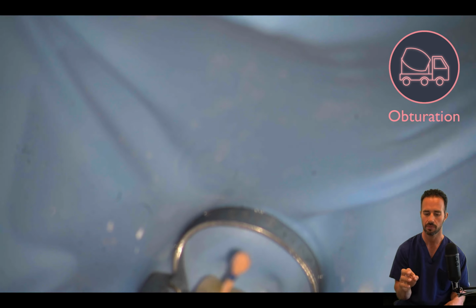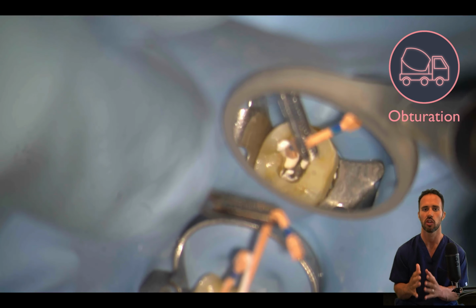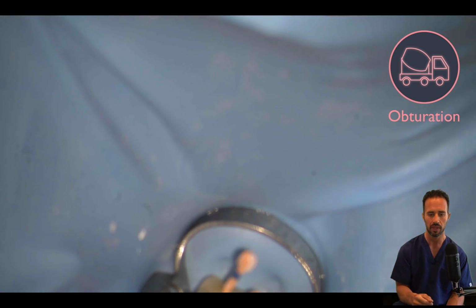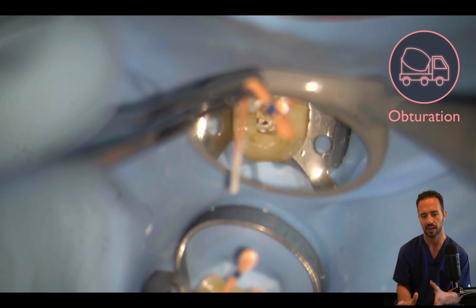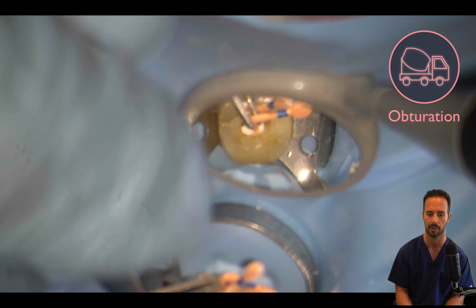And you'll notice that I'm using the 30 gutta percha cones, even though I instrumented to size 35. Remember, oftentimes with the BC sealer, it's relatively thick. You'll find that using the matching cone will not allow it to seat all the way. So we typically use one size down. And our MB canal, as I'm seating the cone there, you'll notice it doesn't want to go all the way to length. That's because it actually merges with the ML, just like I mentioned. Okay, so don't be upset if your MB root filling doesn't go all the way to length, because it's not going to go past the point where it merges with the ML.